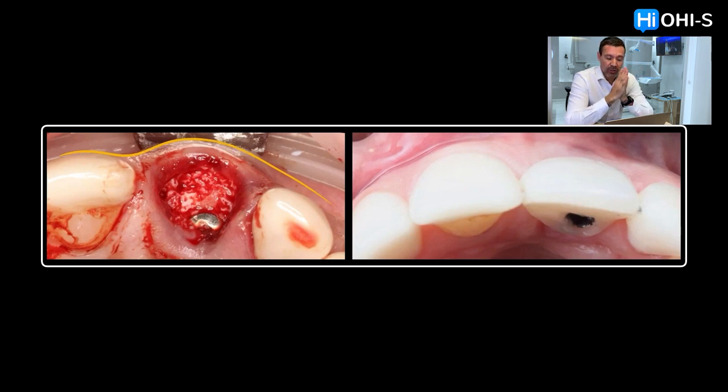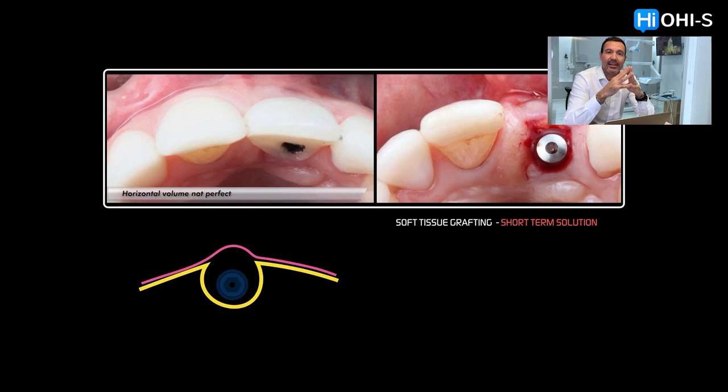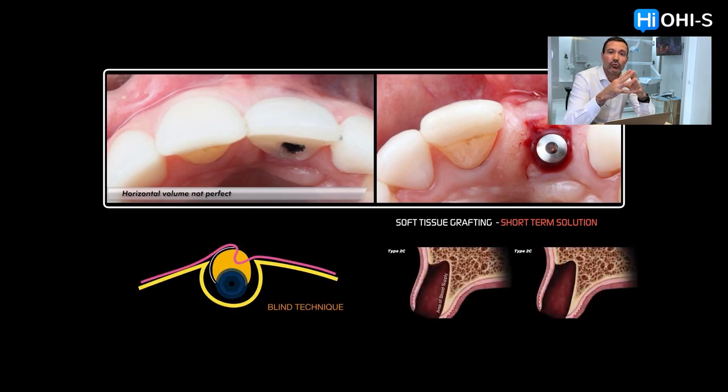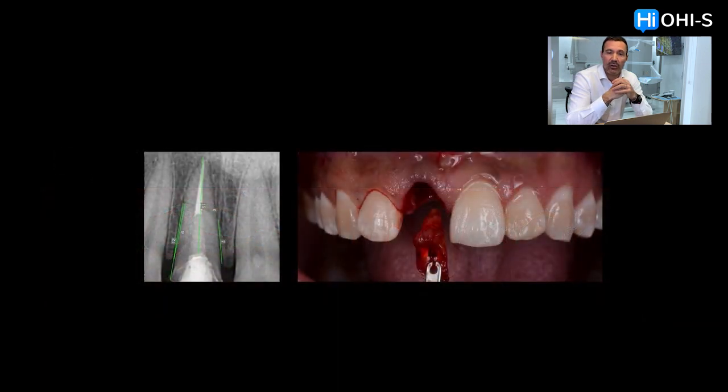The guided surgery to avoid wrong implant 3D positioning as well. Today we're using amazing 3D guided printer machines, so even in the house we don't need a lab to make these guides. We can customize them, design them, print them, and use them in our patient's mouth to be more predictable at the time of implant placement, and also to reduce the time and cost for the patient and for us as well.